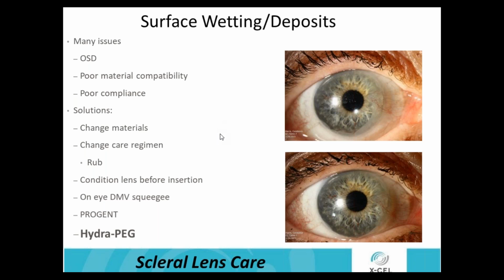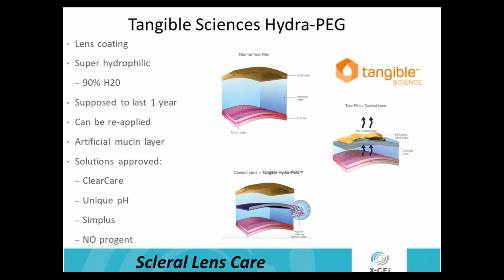What I'm getting to on the other end to avoid some of this is we can treat the surface of these lenses. So you may or may not have used Tangible Hydra-PEG, but Tangible Hydra-PEG is a great option. We can't make patients compliant, but it helps with non-compliant patients in the fact that Hydra-PEG is polyethylene glycol.